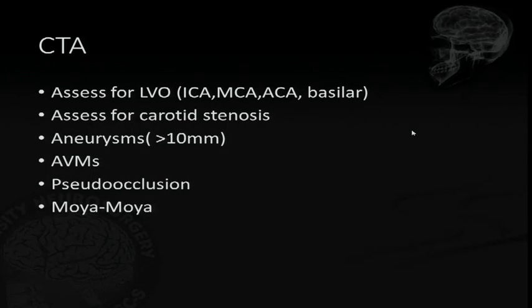Very few patients that we cannot get an IV on will just get that to assess for thrombolysis right there. And then they'll get them back for the CTA 20 or 30 minutes later once they get the IV. So that's your initial assessment. That's what you want to tell them based on just your CT without.